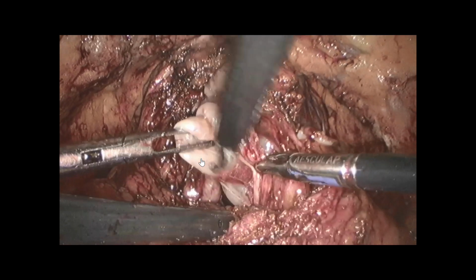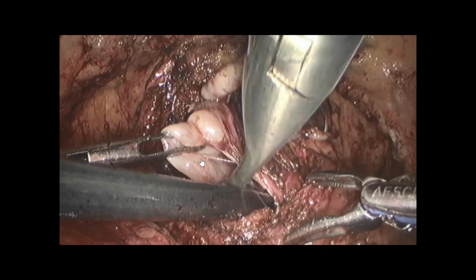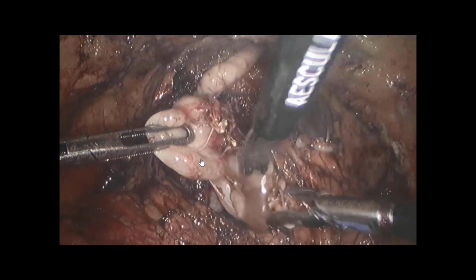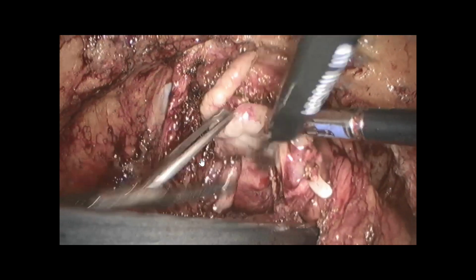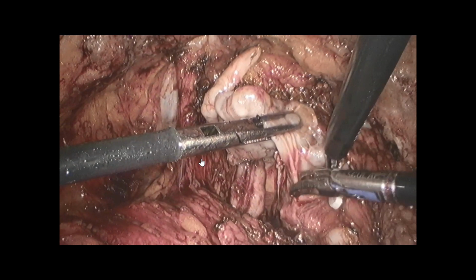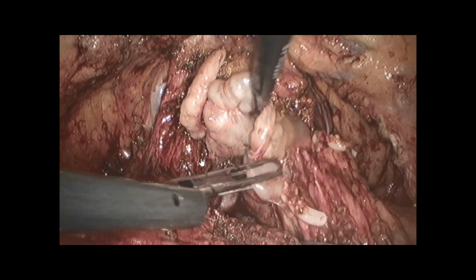So here, it's the beginning of the pedicle. I will place Hem-o-lok clips. And the orientation of the surgery is to reach the previous Hem-o-lok clip. So we will go like this, just following. And my assistant is just lifting up and showing me what I have to do. So you see, she grabs again to take out the seminal vesicle. It's possible to leave the tip of the seminal vesicle if you want, but most of the time I remove it. You see again, up, she removes.